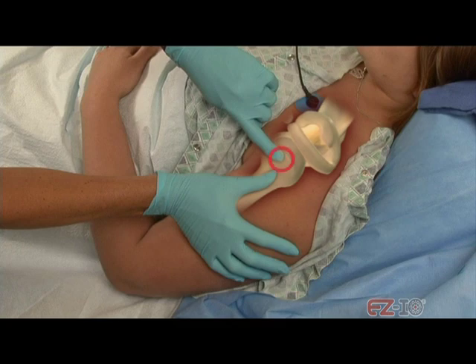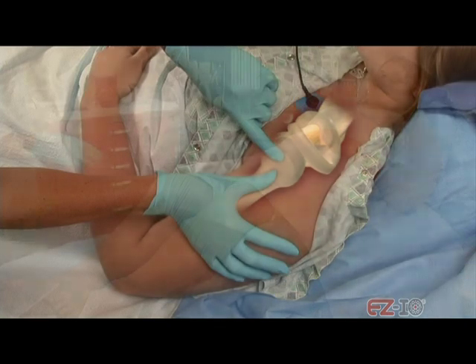VitaCare recommends the 45 millimeter needle on patients weighing more than 40 kilograms. The humerus is the preferred site for patients who are responsive to pain. Once the insertion is completed, secure the arm in place to prevent movement and accidental dislodgement of the IO catheter.